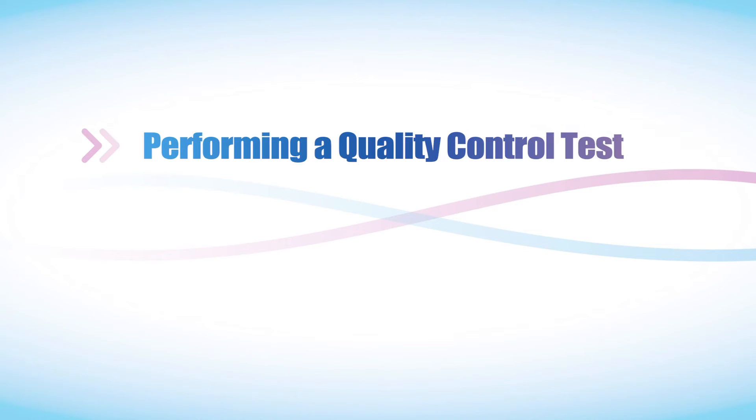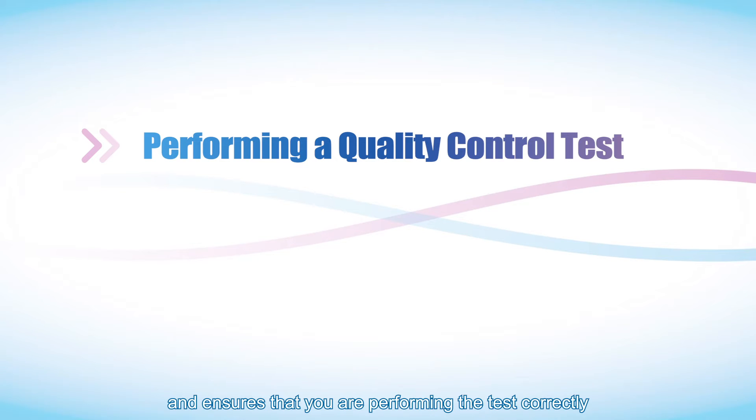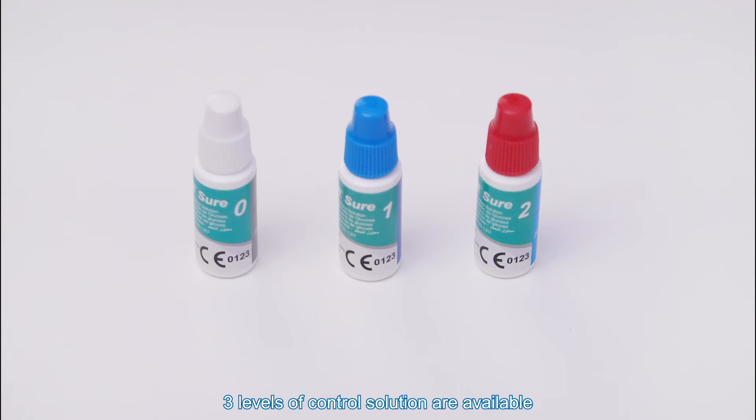Performing a quality control test. The quality control test confirms that the test strips and meter are working together properly and ensures that you are performing the test correctly. Three levels of control solution are available: control solution 0, 1, and 2. Control solution 1 is quite adequate for most tests.